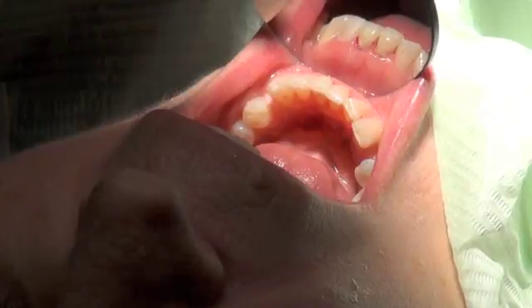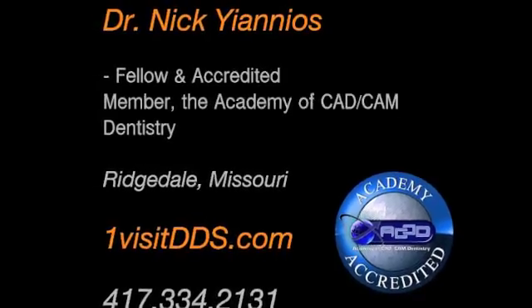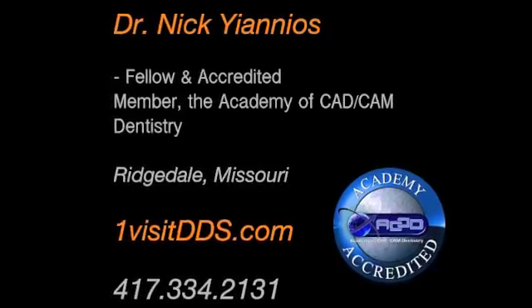Ninety-five minutes has elapsed without molds or temporaries, independent of the dental laboratory, with one local anesthetic injection. Of course, the patient was very pleased.